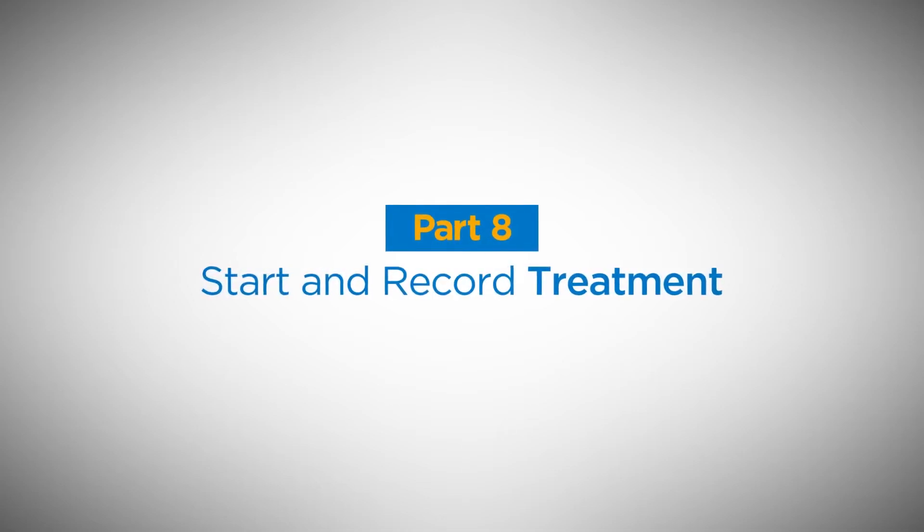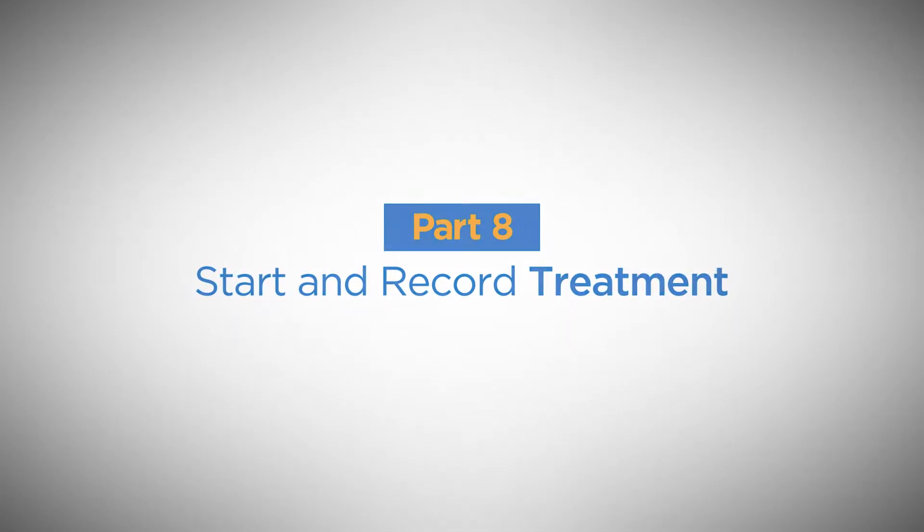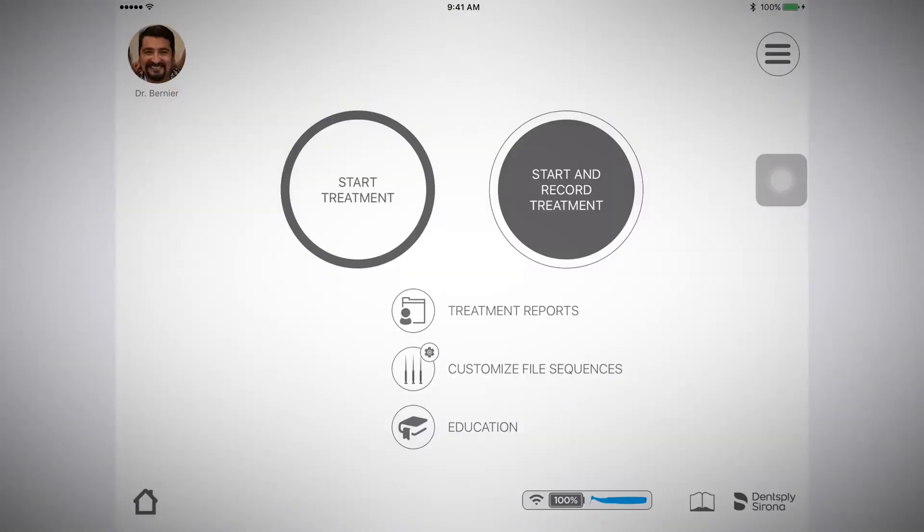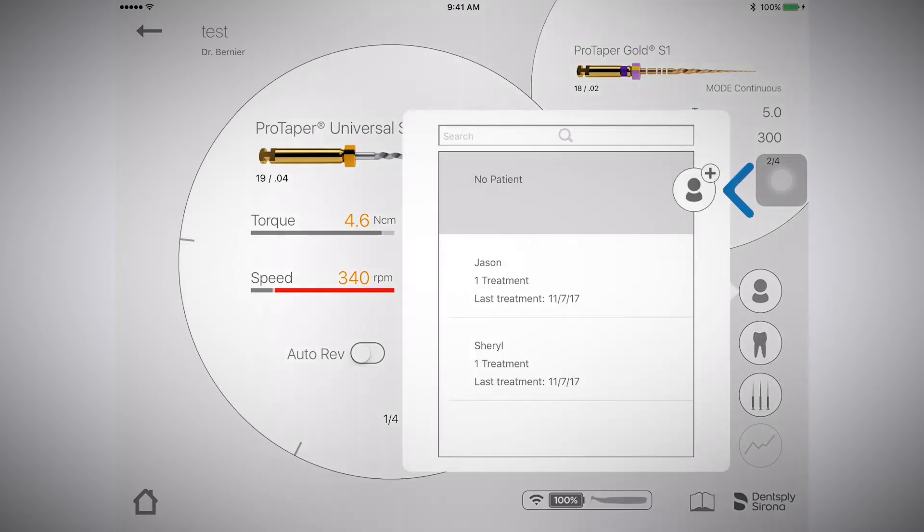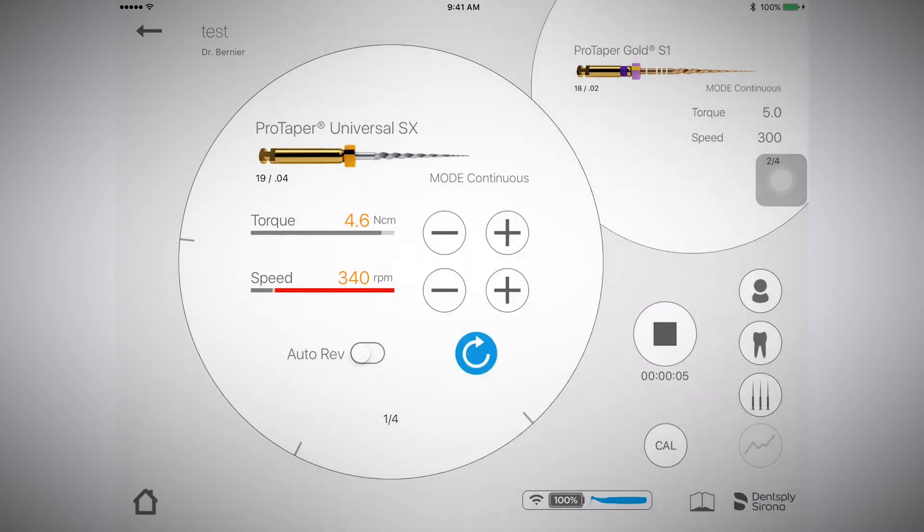Start and record treatment. From the home page, select start and record treatment. In the right corner, select the person icon. Select a patient.